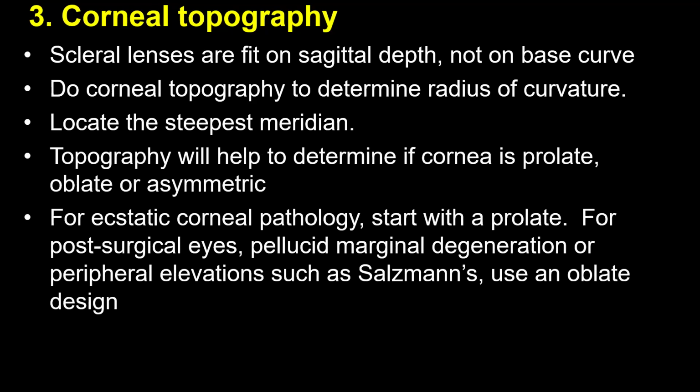In the case of one eye, oblate is more curved at the periphery, and prolate is more curved at the center. So you need to be aware of all of these things so that you know what you are getting, because these are custom contact lenses, and you need to know exactly what you're getting. It's not like something you're picking up from the shelf, over the counter.